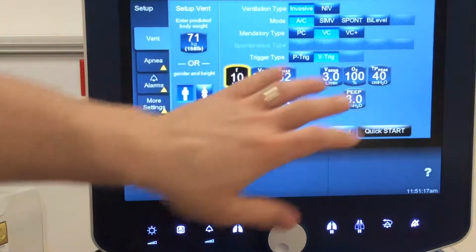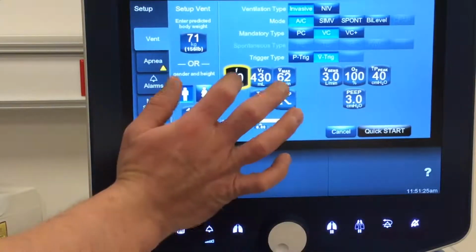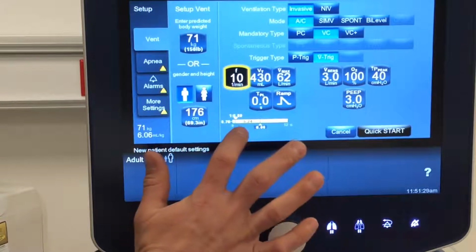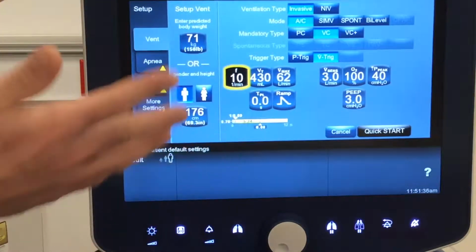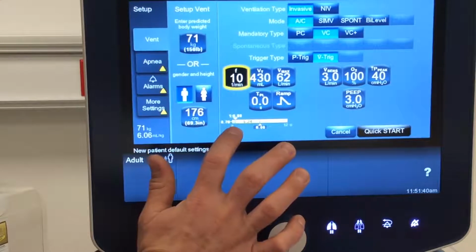But essentially all these blue tiles represent things that we have the ability to directly set and control in volume ventilation. Okay, so one cool thing I like about these vents is, once again, if I touch this and I go to turn it, one unique thing that the Puritan Bennett Ventilator series does is it shows us some important things that we would otherwise have had to calculate in ventilators of the past. But it does some of that guesswork for us here.